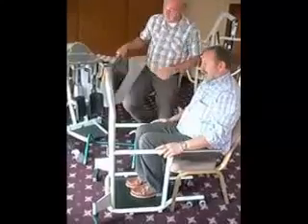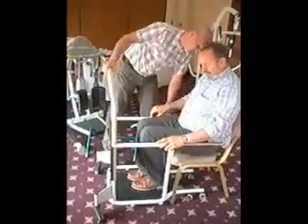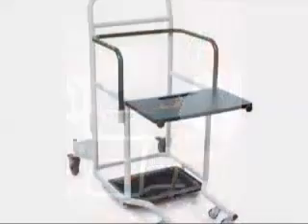Thank you. To the back again. Close the steel bars — I will help you. Thank you. And then go away.